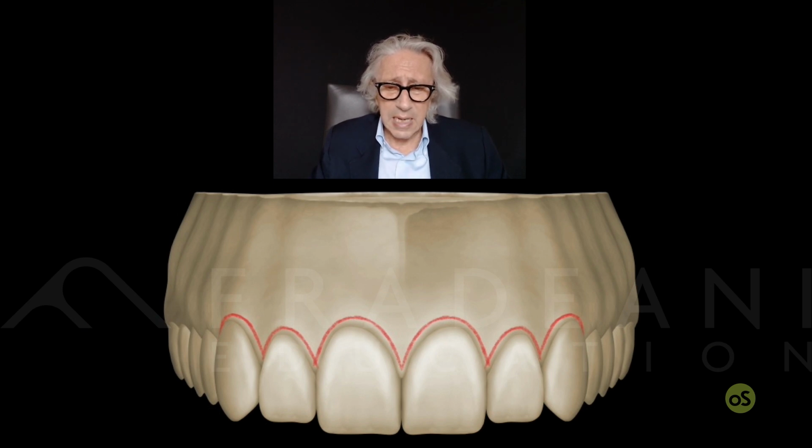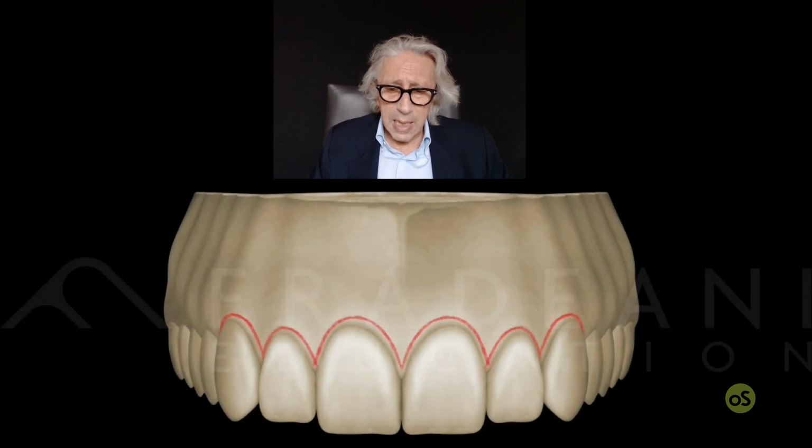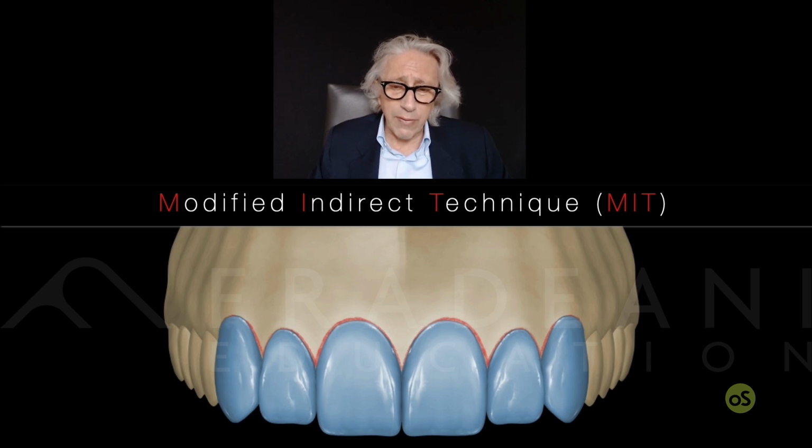It means you can still keep the same middle and incisal third volume, but enlarge the volume on the cervical third, having the chance to design a kind of line 1 millimeter more apical. At this point, once you put your wax in place, you will have an elongated wax-up cervically. But at the same time, this first part of the gingiva on the cervical area being a little bit convex, you will be longer and larger. So the cervical third will not be perfect, will be a little bit larger and longer.